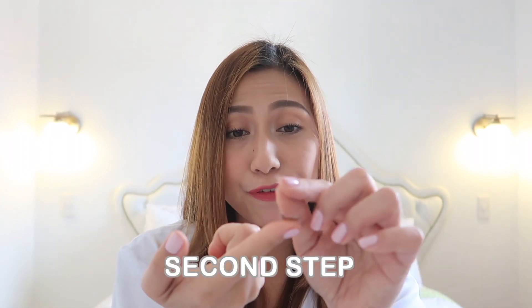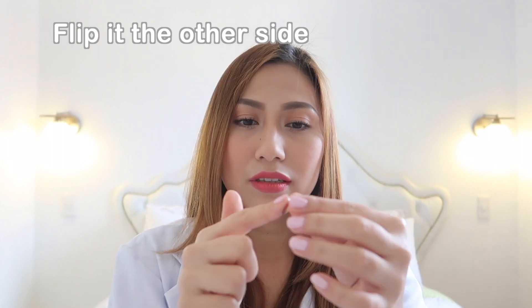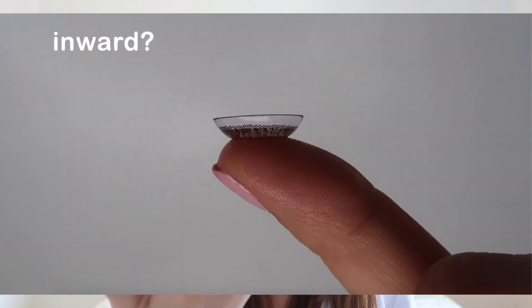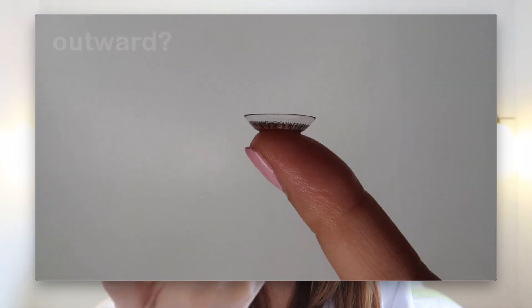Familiarize it, and then second step: flip it to the other side. And again, do the first step — assess the edge of the contact lens, assess the direction. Is it going inward or is it going outward? Is it flaring outward?